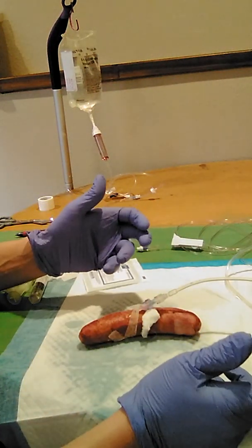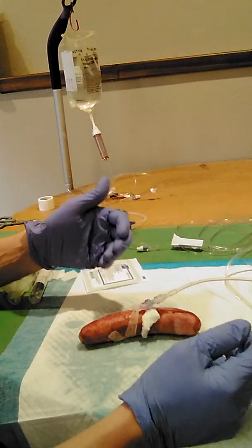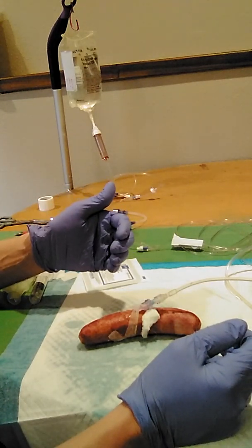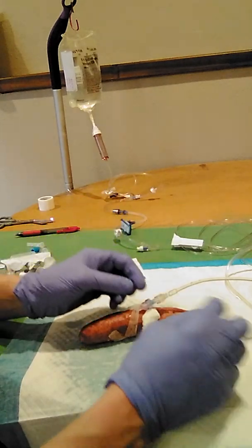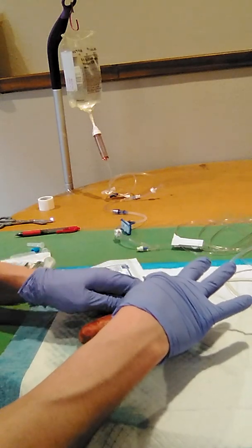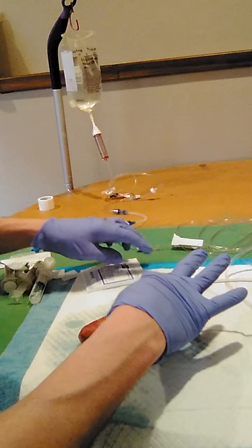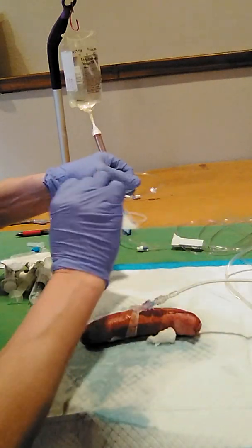So I'm going to identify the patient with 2 means of identification and make sure that I'm prepared to document everything I've done in the MAR. So firstly, I'm going to loosen this tape carefully while holding the catheter. And I'm going to have my sterile gauze ready.